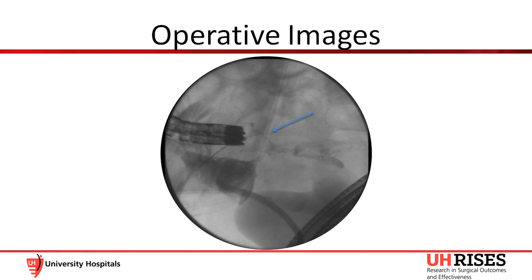We used APC cautery to fulgurate the overlying mucosa to allow better healing after endoscopic closure. Again, the fistula tract is identified by the arrow.